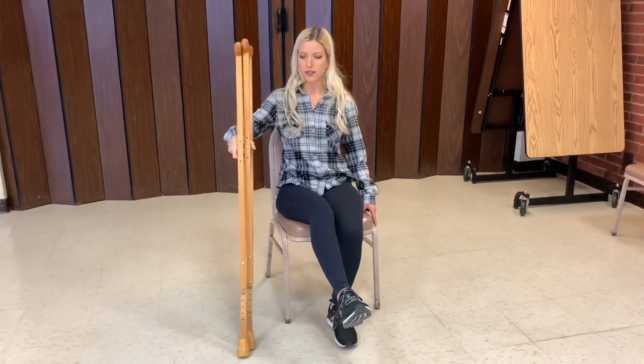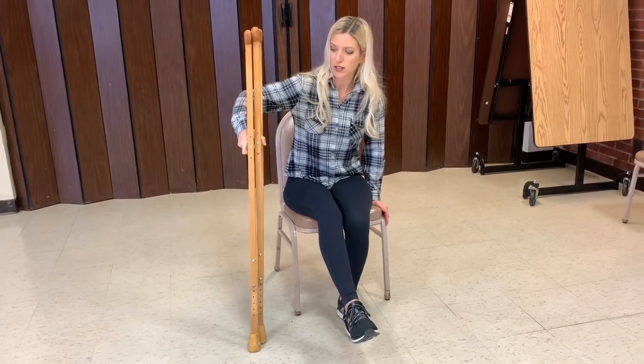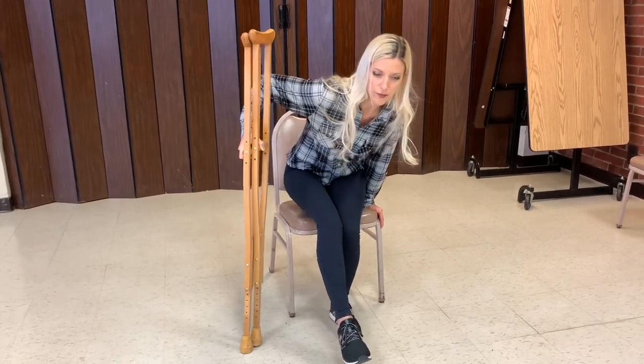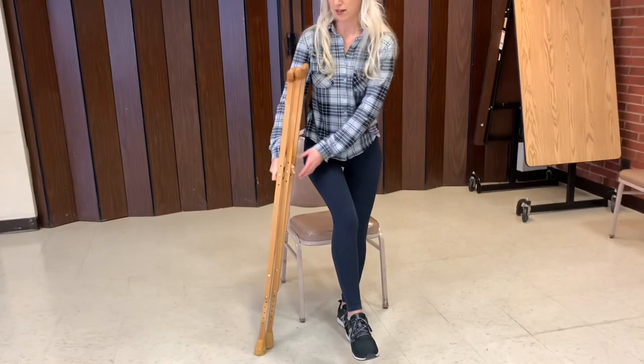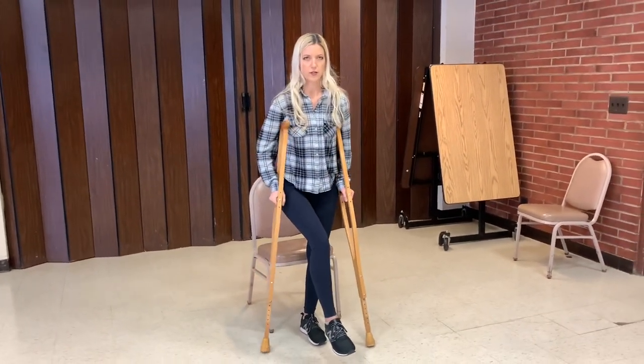And so you're using the crutch on this side as a brace and support on this side to get you safely into the chair. And then when you want to get back up, you're just going to grab onto the seat, hold onto the handles, and push yourself back up. And then bring one crutch around, and you're back ready to go.